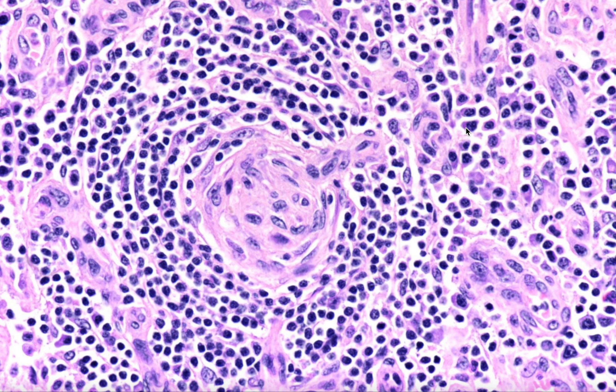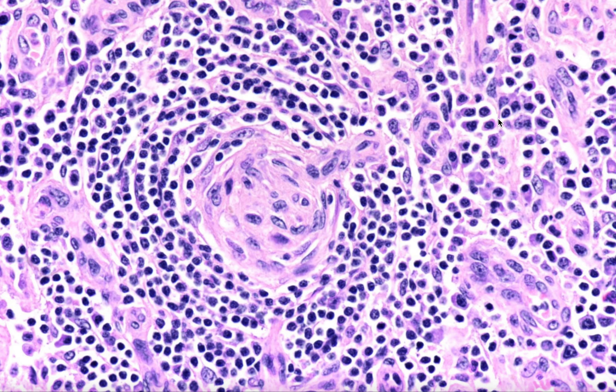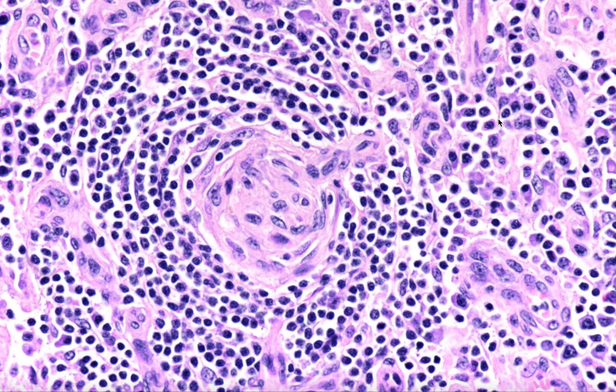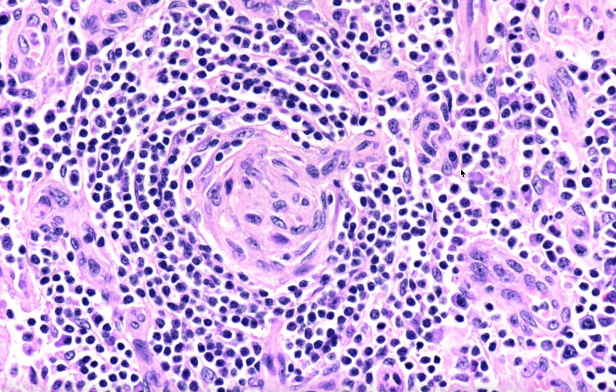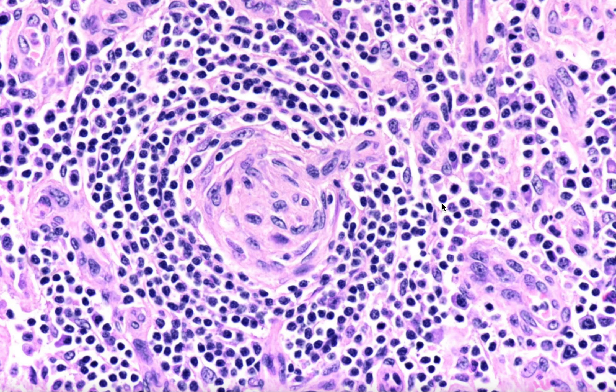You can also have mature plasma cells. These can be either polyclonal or sometimes light chain restricted, but still considered benign in the setting of Castleman's disease.